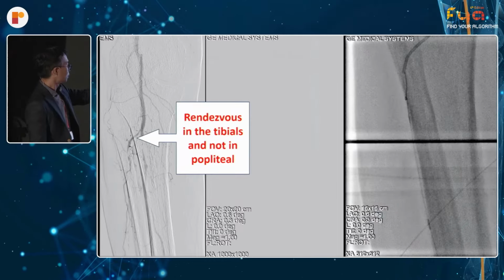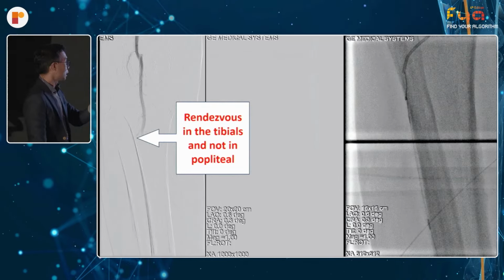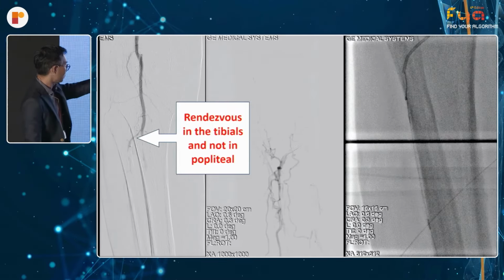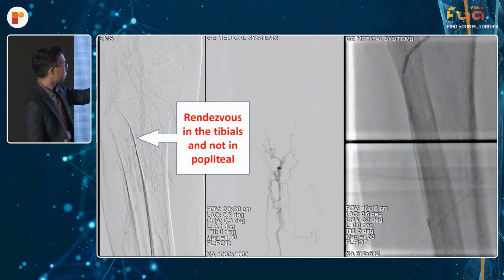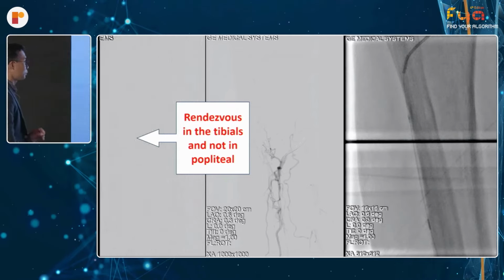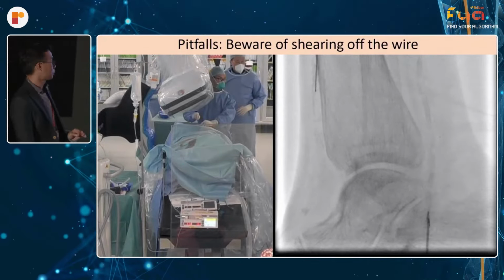For me, my rendezvous in the tibials is to always rendezvous within the tibials itself and not in the popliteal, to avoid this potential pitfall. So in this case, for example, I would position my CXI catheter from the bottom, do a run to make sure I'm back in the luminal space, and this is my rendezvous spot and not in the popliteal artery. This is my personal preference, but if you choose to do it in the popliteal, just be careful that you're not going to lose the inflow to the rest of the trifurcation.